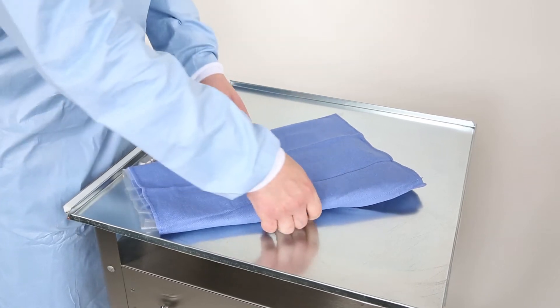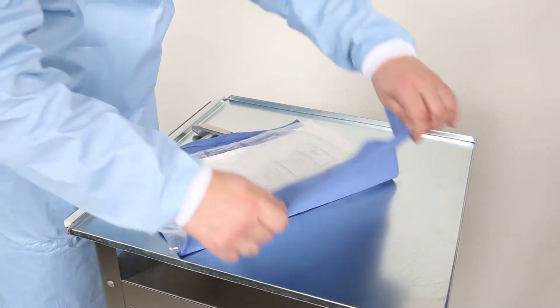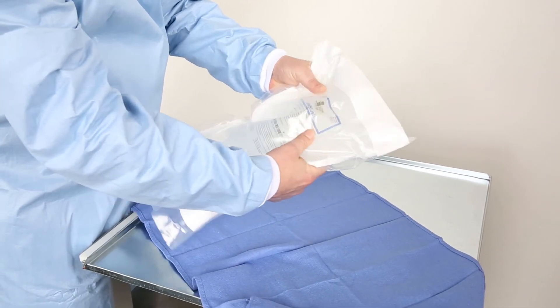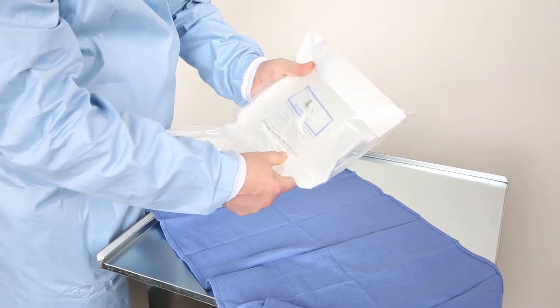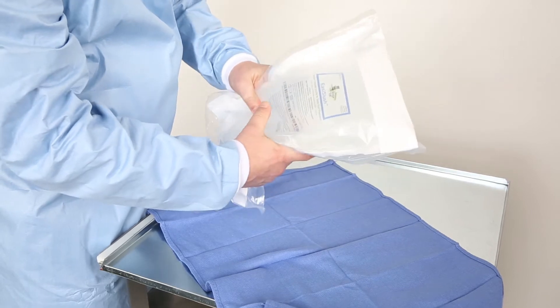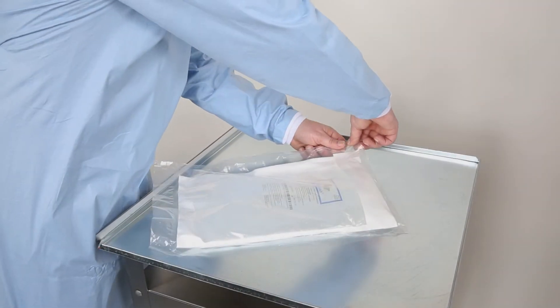After manipulation and prior to use, inspect the sterile barrier pouch and solution bag for perforations or other indications of damage. Discard any product with visible signs of damage to the IV bag or sterile barrier pouch as sterility may be compromised.